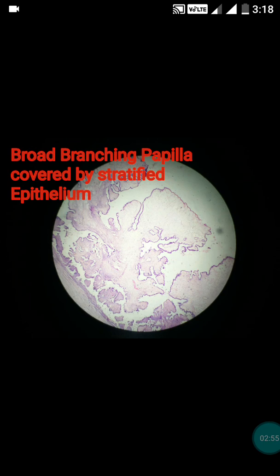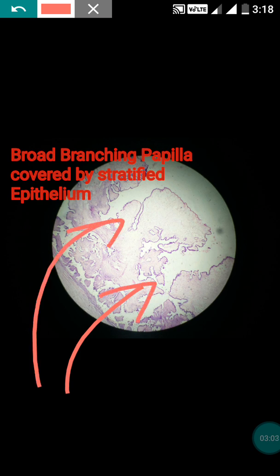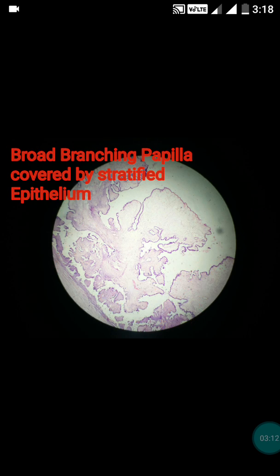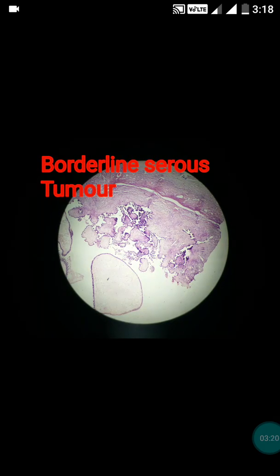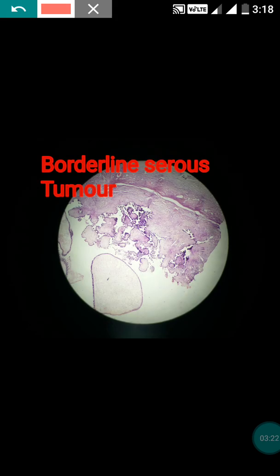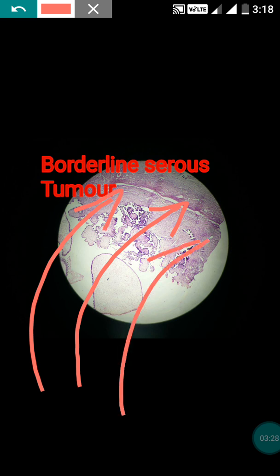In the borderline serous tumor, you can see broad branching papillae covered by stratified epithelium — this is the papillary cystadenoma of the ovary. To call the tumor borderline, there must be absent stromal invasion. In this figure, you can see the stromal invasion is not seen; the underlying ovarian stroma is completely free.